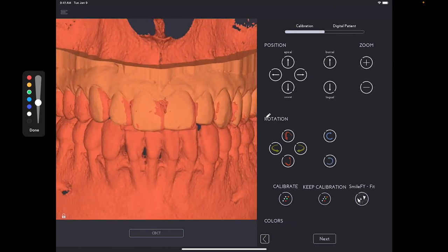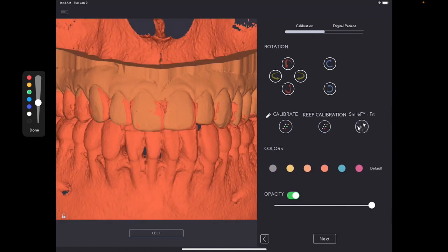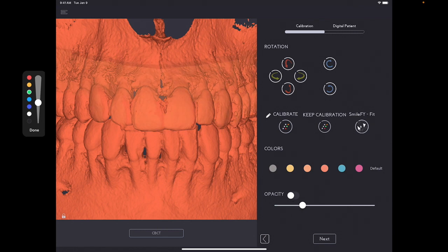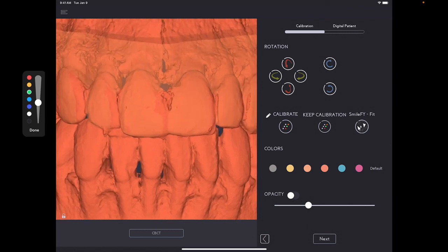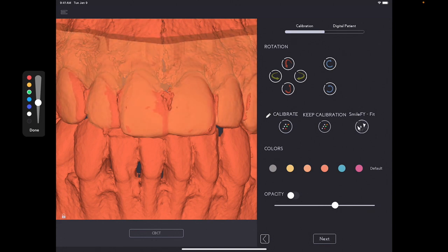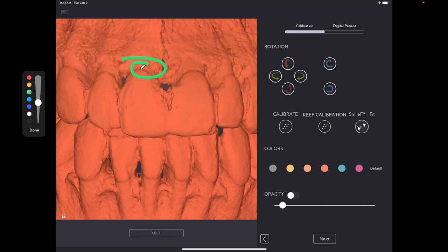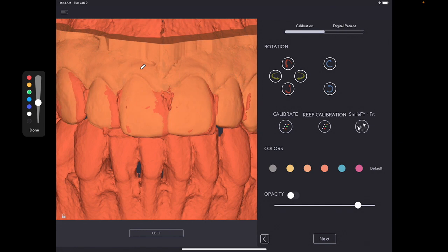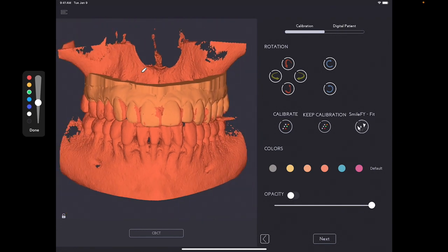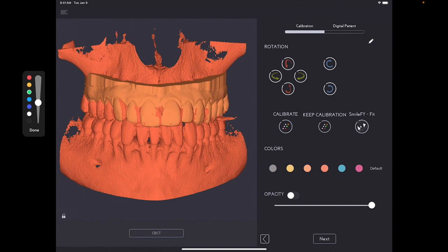Over here, if I use opacity, let me just change the opacity. Here, as you can see, you can visualize now the bone file and you can use the original STL to measure the gingiva that you have over here.